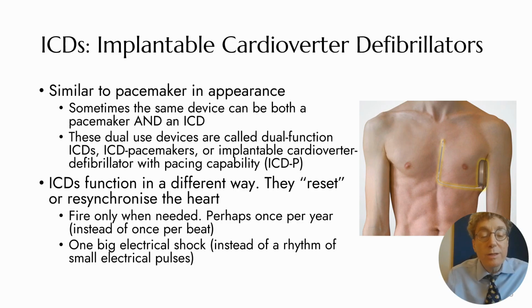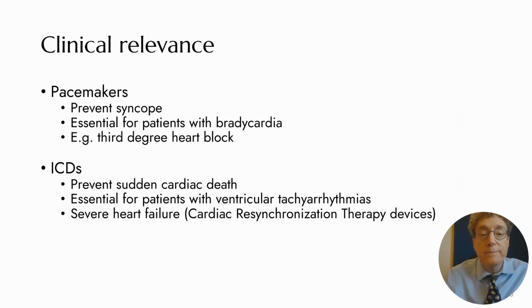Now, when a defibrillator does fire, it delivers one very big electrical shock instead of a rhythm of small electrical pulses. So with a pacemaker, most people who have pacemakers implanted, they're not really going to feel every single electrical stimulus, but you can be sure that when a patient has a defibrillator that fires, they will notice it. It's literally shocking. For many of them, it's quite frightening.